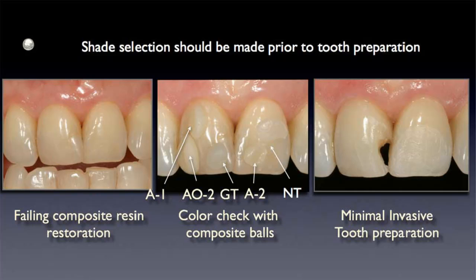And so, in natural teeth, this is a really common type of layering to use, like an A02 for class 4, an A1, A2, and a neutral translucency. I find that combination all the time to work very well in typical types of situations.